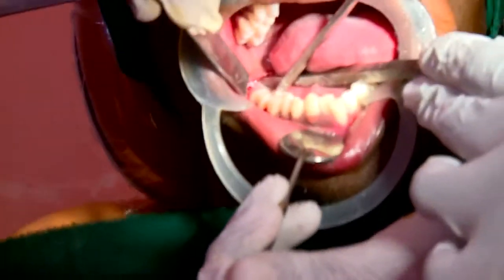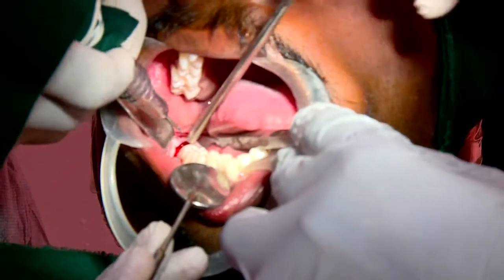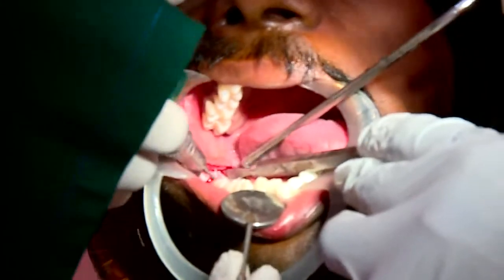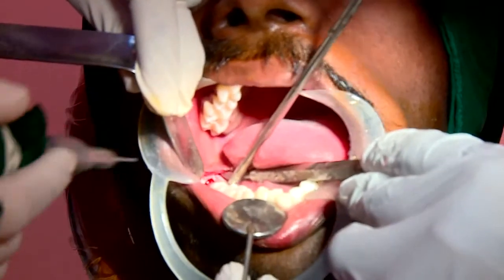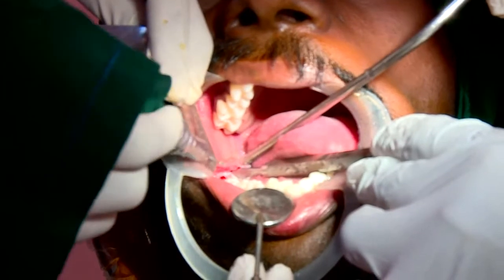So sir is splitting the tooth now. Splitting the crown minimizes the amount of bone removal that we have to do. Sir is splitting it obliquely in a horizontal plane, so from up to down it is going to split.